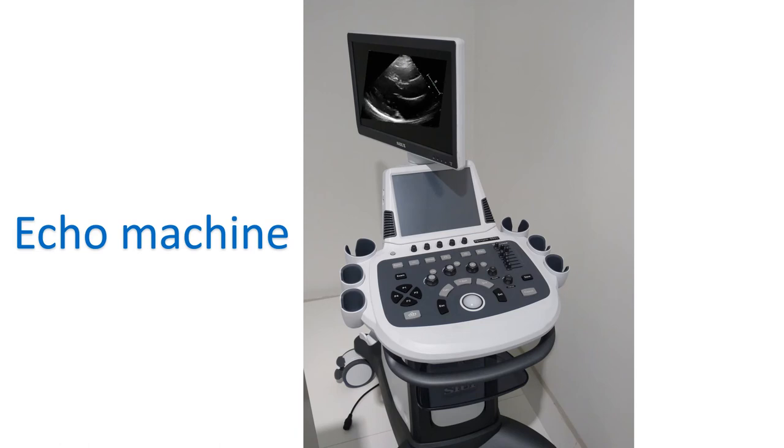ECG leads may also be connected to get signals for timing along with the echo images. ECG is the electrical recording of the heart. The echo images and videos can be saved to a DVD, digital versatile disc, or pen drive as well for transfer to another computer.